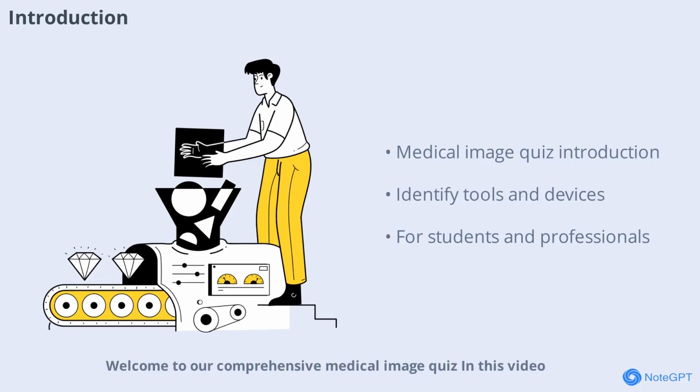Welcome to our comprehensive medical image quiz. In this video, we'll guide you through a series of essential medical tools, devices, and procedures, all illustrated with clear images. Whether you're a student, a healthcare professional, or just curious about medical equipment, this video will help you sharpen your identification skills. Each scene will present a new image, followed by a discussion of its features, uses, and significance in clinical practice. Let's begin our journey into the world of medical instruments and procedures, starting with airway management devices.